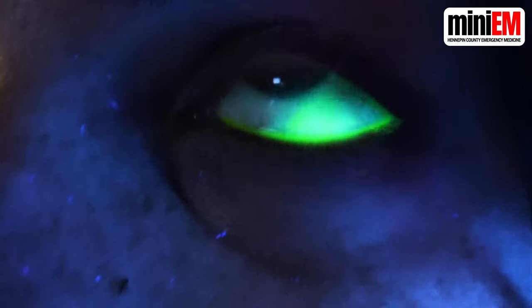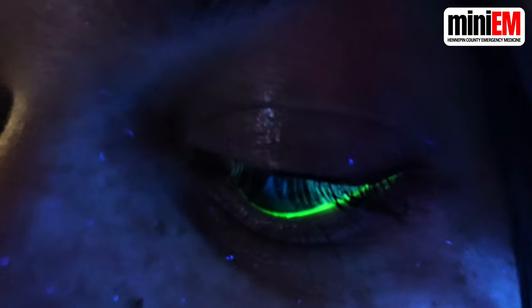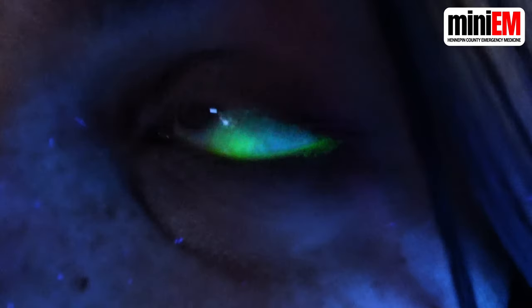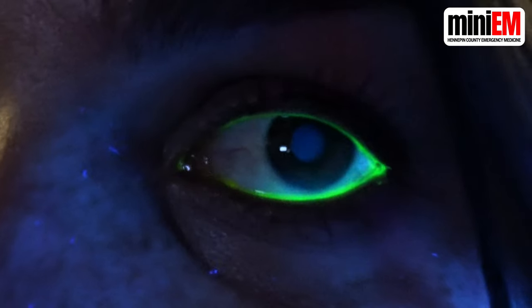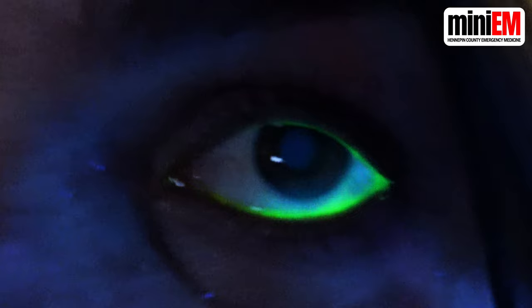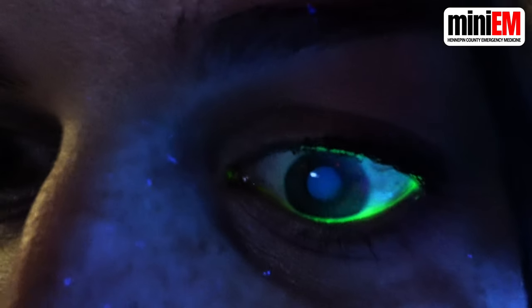Fluorescein will mainly show you corneal pathology. Oftentimes the conjunctiva will have mucus that picks up staining, but this isn't super clinically relevant. Normally the cornea will not uptake dye.